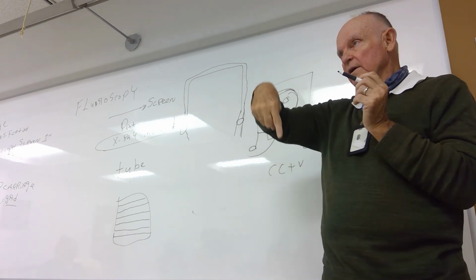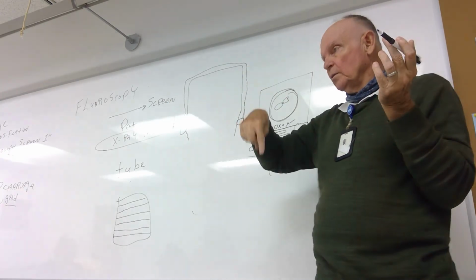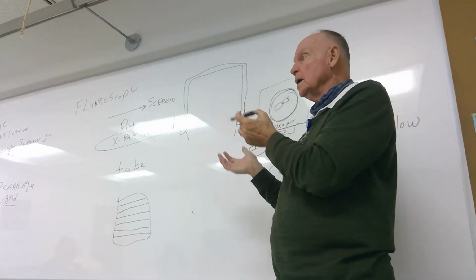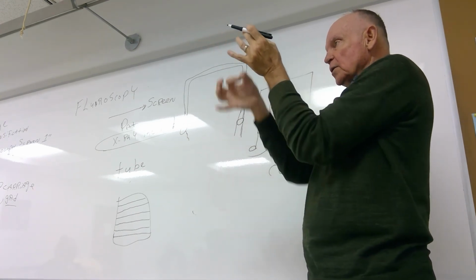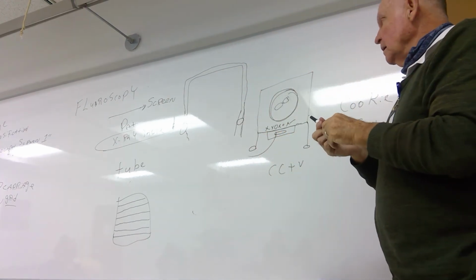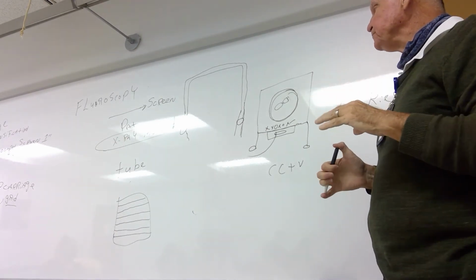What goes through the core then? The barium. You with me? The barium will go through the core. If the core was there, nothing would move. It'd be completely obstructed. But because it grows in that circular fashion, and it's got that opening, the barium will go through, and you just see a little stream. And they make the diagnosis. And that's a radiology term, apple core lesion. It's what they use.